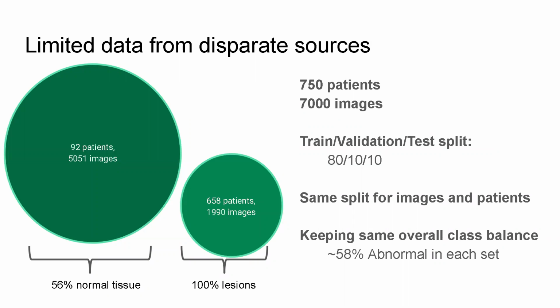So iSono has a portable 3D ultrasound, but they don't have very much data from their own device at this point. Instead, I was given a proxy dataset from 2 different data sources. One is primarily video. It's from a fewer number of patients. And the rest are from an academic source and are only pictures of lesions of different subtypes. So I already had a strange patient imbalance.